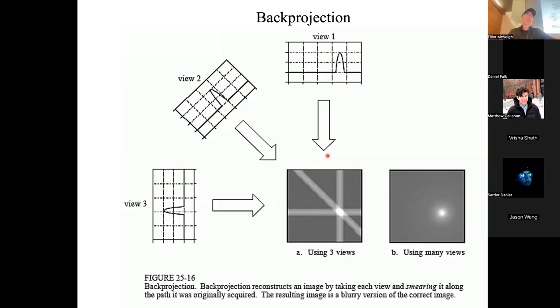And we do exactly what we did with the previous example. We just take this projection and evenly distribute it back on the image, right? So this stuff projects down to positive signal here, and all of this stuff projects down to zeros, okay, for this projection. And you can see as I'm doing more projections, I'm going to build up a very strong signal where my disk is.